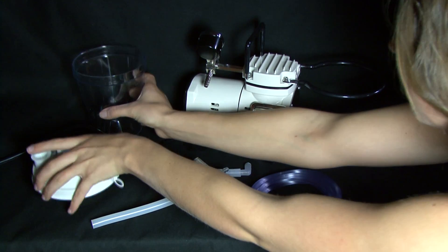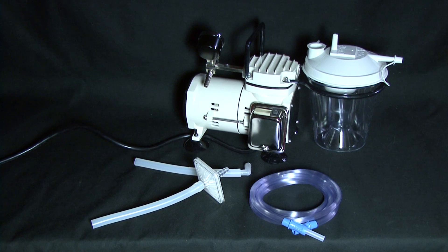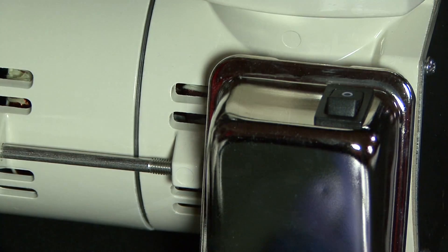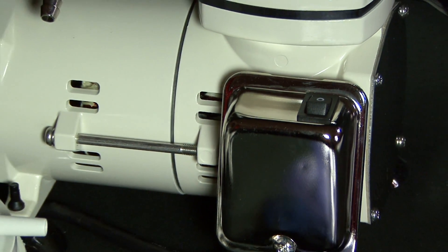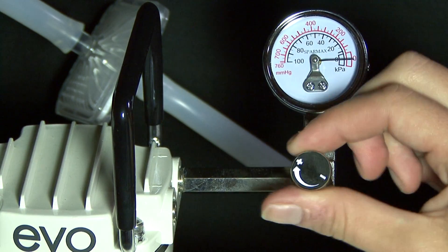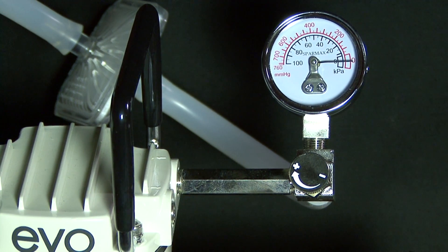First, seal the canister properly with the lid and then put the sealed canister into the bracket. Make sure the power is in the O or off position. Turn the pressure-adjusting knob to the minimum suction power. This reassures it's safe to plug the power cord in.